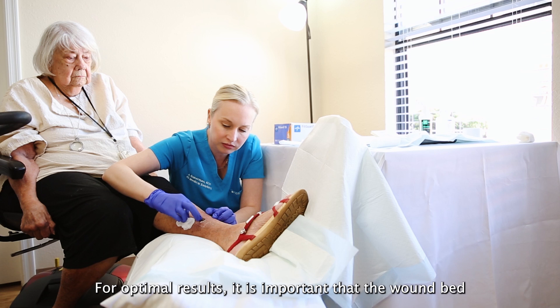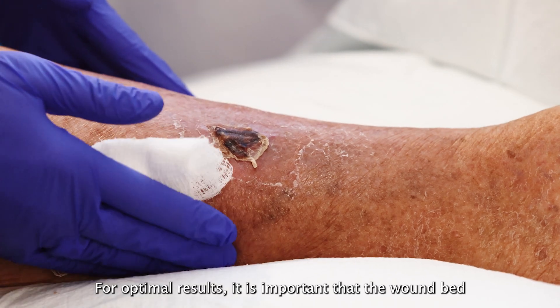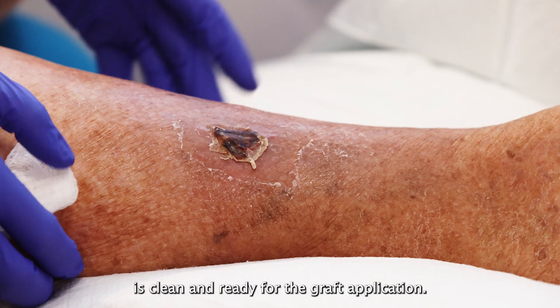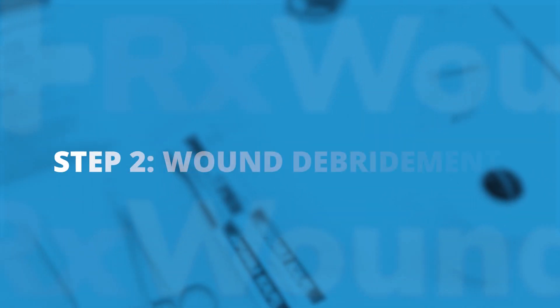For optimal results, it is important that the wound bed is clean and ready for graft application.